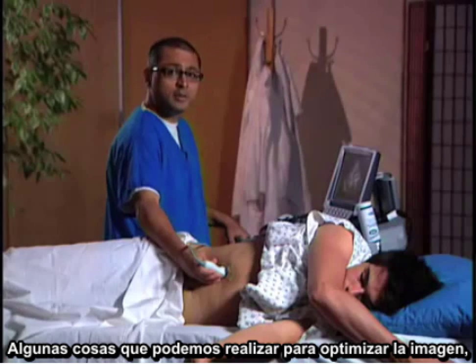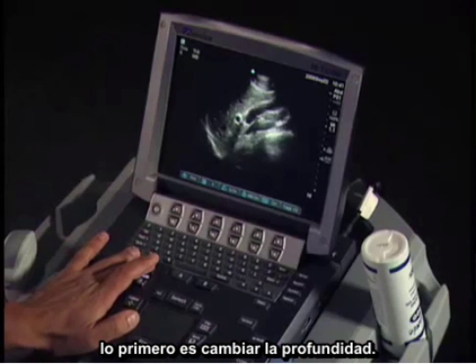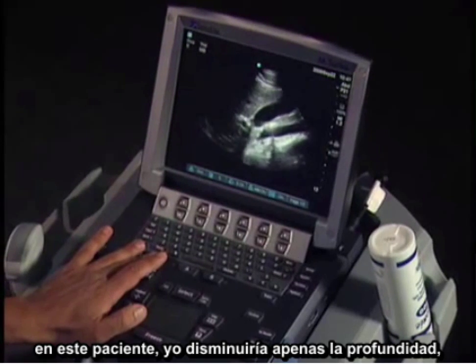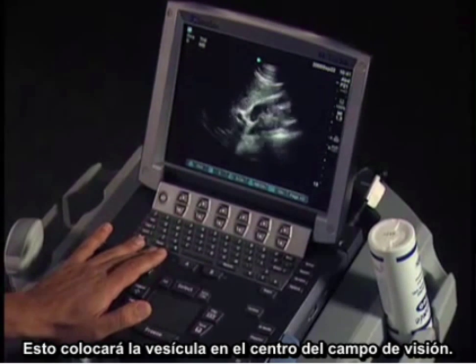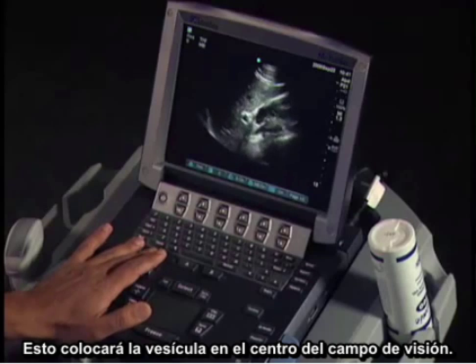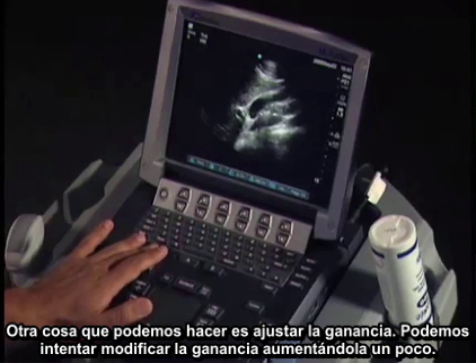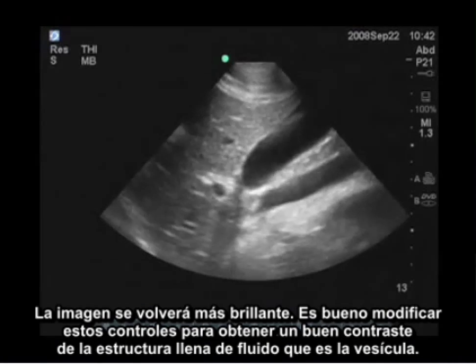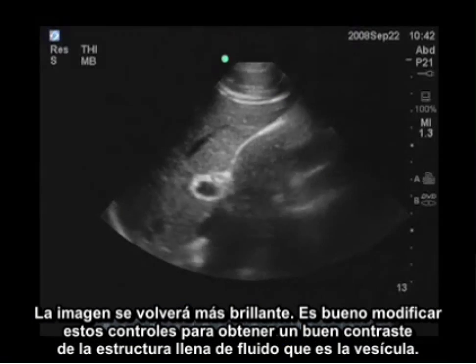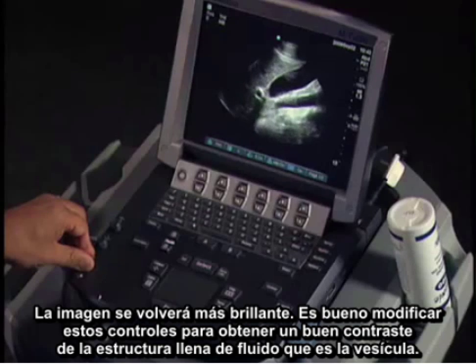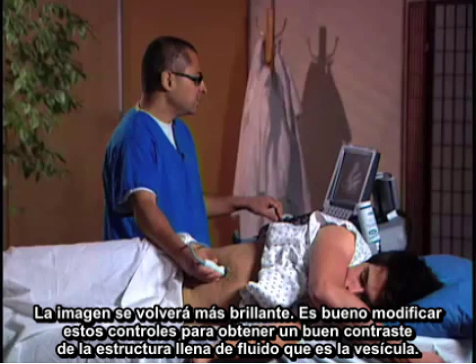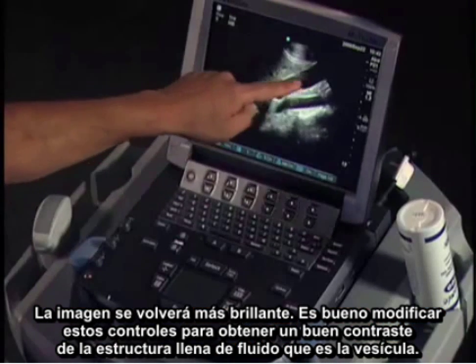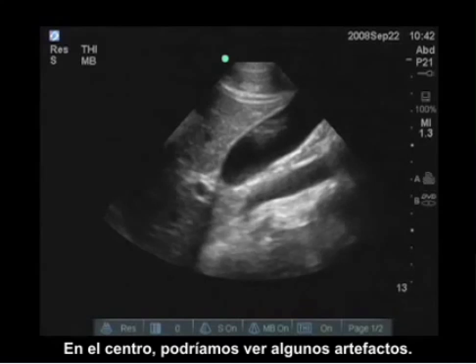To optimize the image, first adjust your depth. In this patient I may decrease the depth slightly to bring the gallbladder better into the mid-center field of view. You can also adjust the gain slightly higher or lower. You want to optimize these settings to get good contrast of the fluid-filled gallbladder in the center, and also to notice any artifacts.